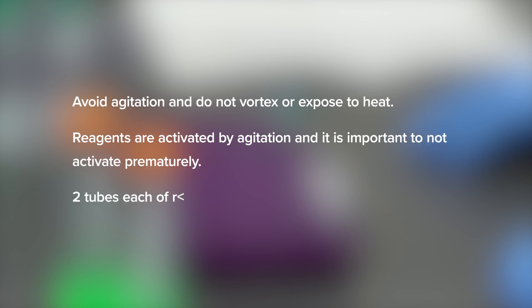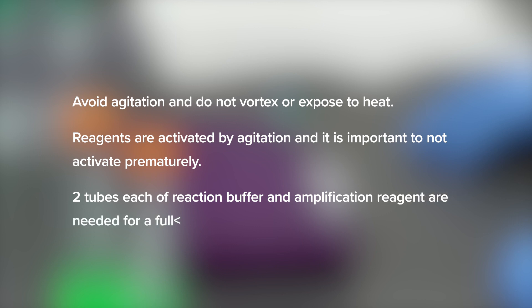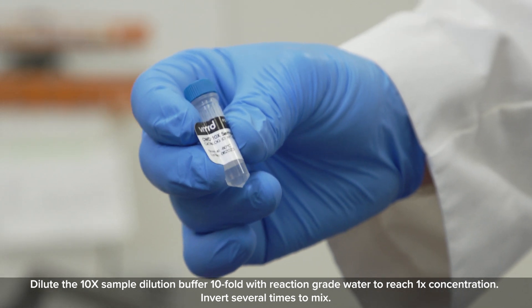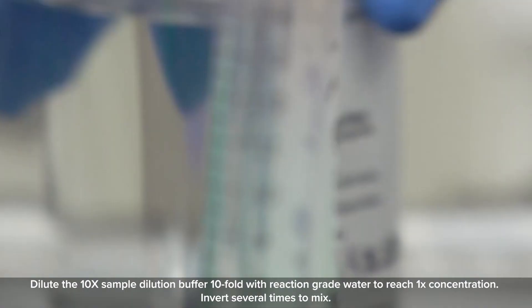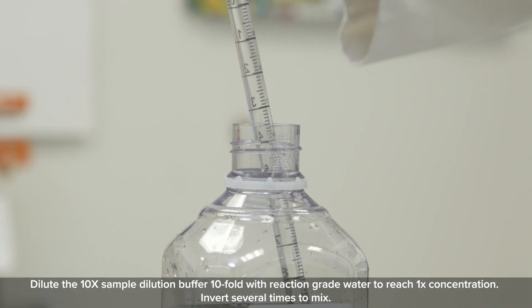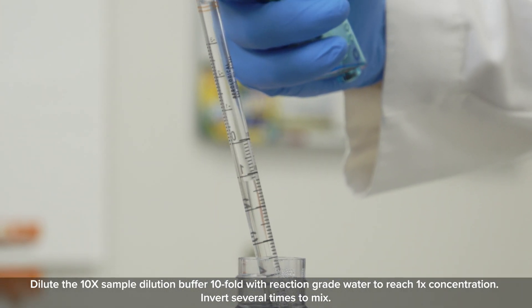Two tubes each of reaction buffer and amplification reagent are needed for a full 96-well plate. Dilute the 10x sample dilution buffer tenfold with reaction grade water to reach 1x concentration. Invert several times to mix.